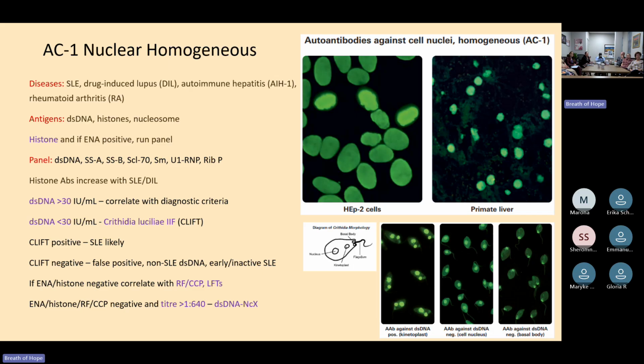And so what we do is, it's almost similar to the slide, we add the patient sample. So if there is double-stranded DNA in the patient sample, that is your high avidity kind of double-stranded DNA, the kind that you would associate with SLE and possibly with renal complications of SLE, then you will find a positive result. So it's a way of saying, all right, it's likely that the double-stranded DNA that we're observing is actually related to SLE.